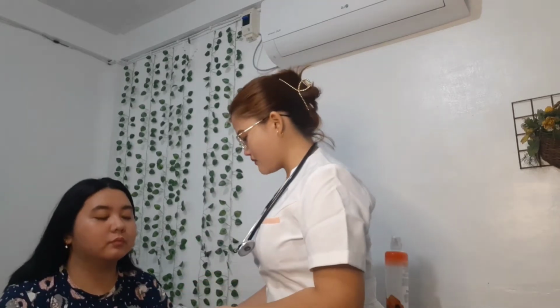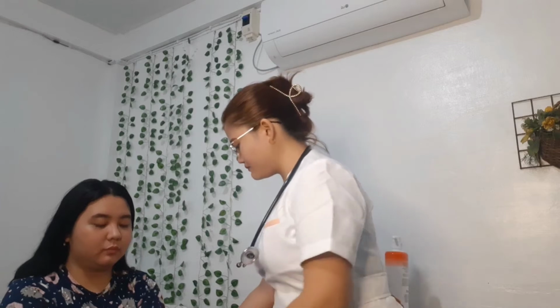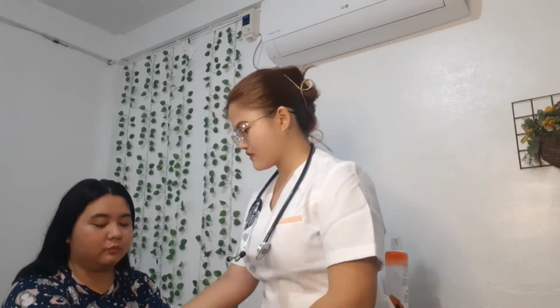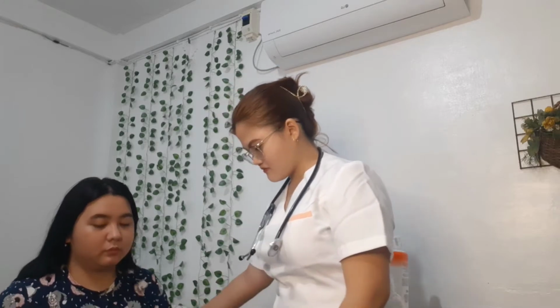Next, I'm going to check the extremities and mucous membranes closely for color. Why do we need to check the extremities of the patient? It is to ensure the need for oxygen administration. So, ma'am, patingin po ng inyong kamay. Okay. Kabila po. Okay. Tayo po kayo, ma'am. Okay, so thank you po, ma'am.